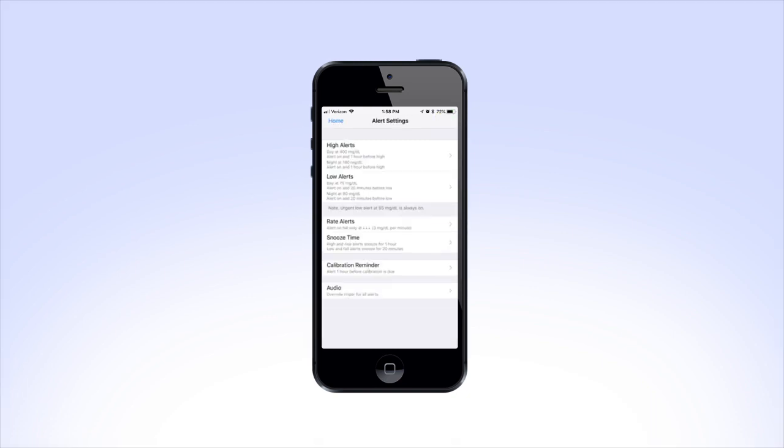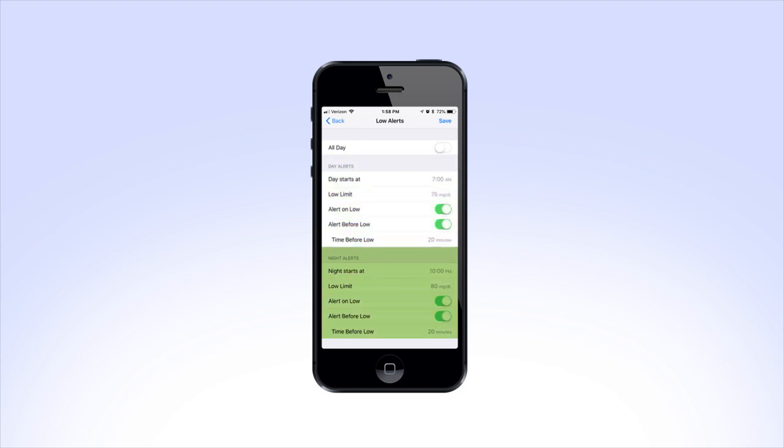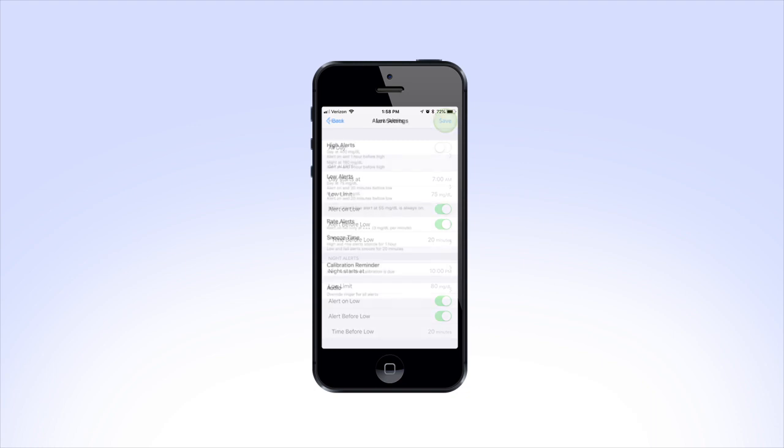Now we'll look at Low Alerts. Tap on Low Alerts and you will see the screen is very similar to the High Alerts section. As with High Alerts, you can choose to have a single limit and set of alerts for the entire day or choose to have two separate sets of alerts for day and night. Continue to set your low limit and alerts. When you are done, press Save.